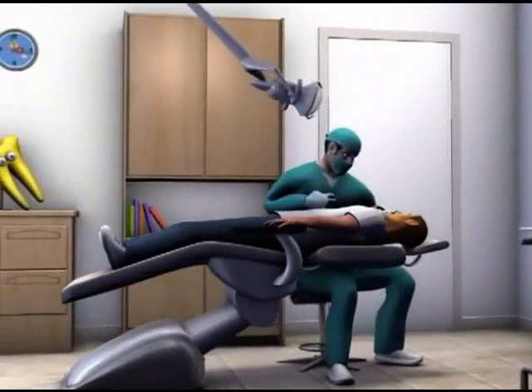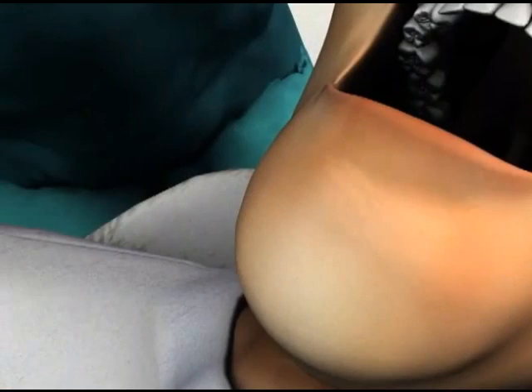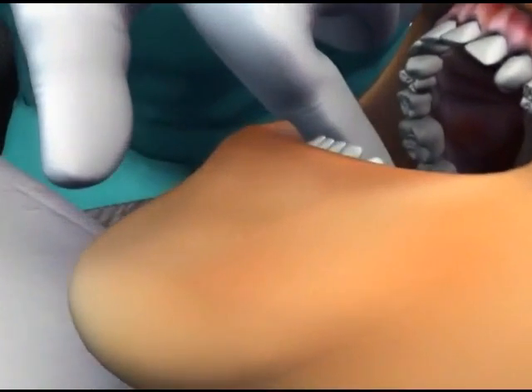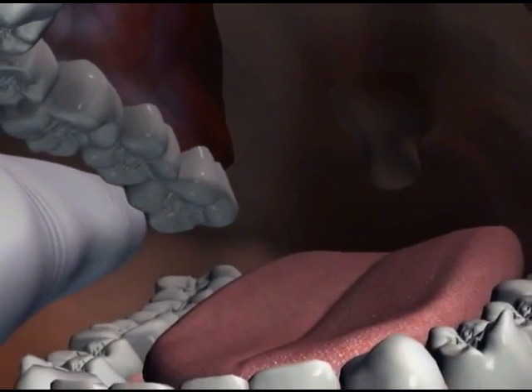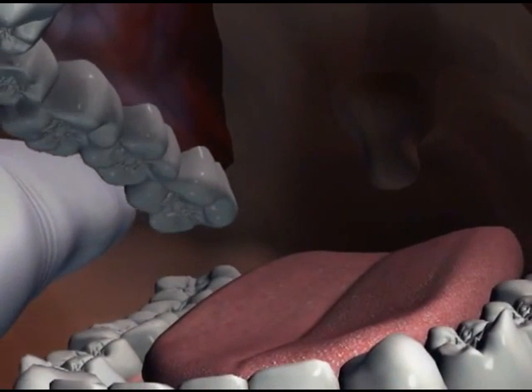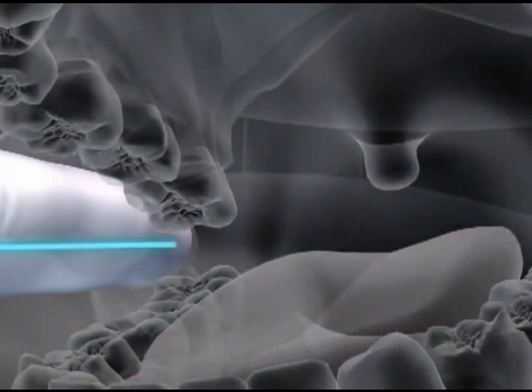the possibility of syncope. Our tour begins with the patient's mouth opened widely and the patient's head turned slightly toward the operator. The operator's finger palpates the greatest depth of the coronoid notch and moves the finger laterally to make the tissue taut. The finger is held parallel to the mandibular occlusal plane so that the middle of the finger coincides with the deepest part of the coronoid notch.